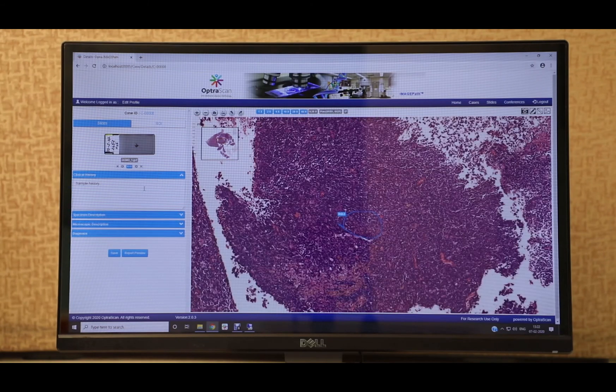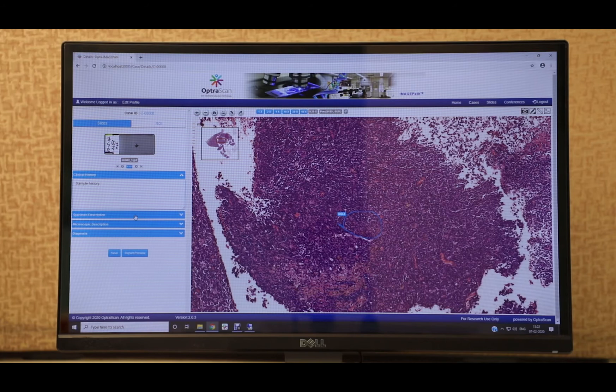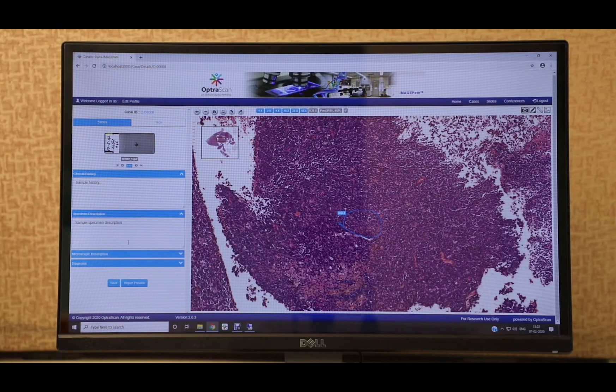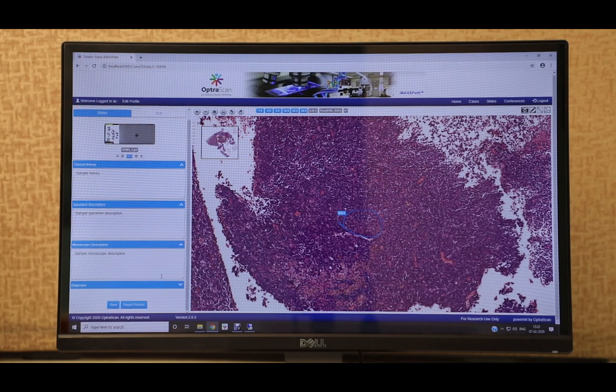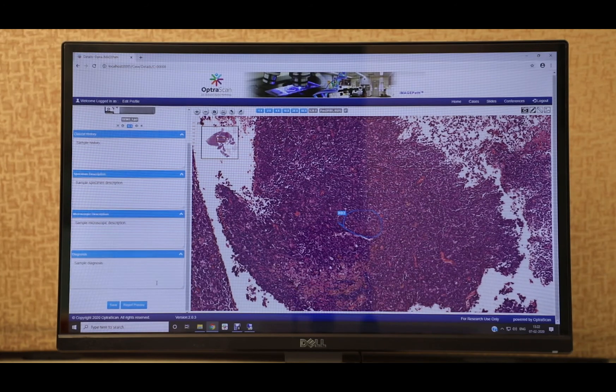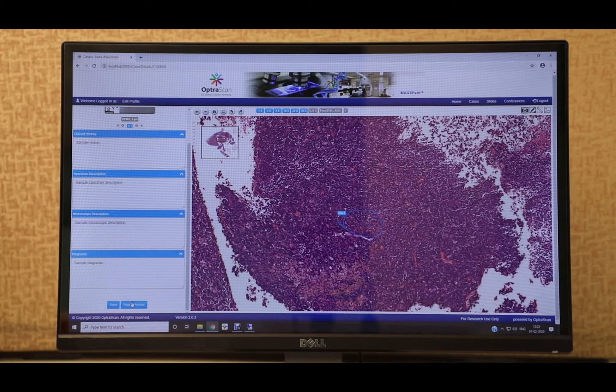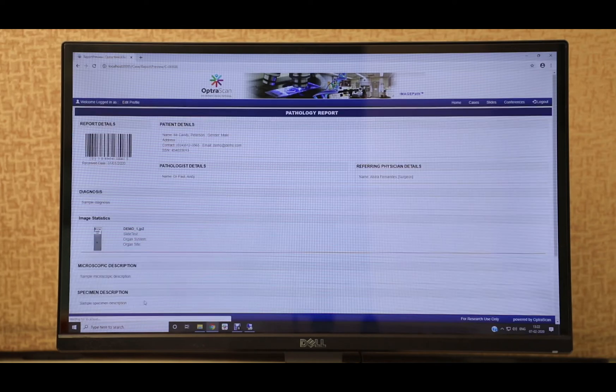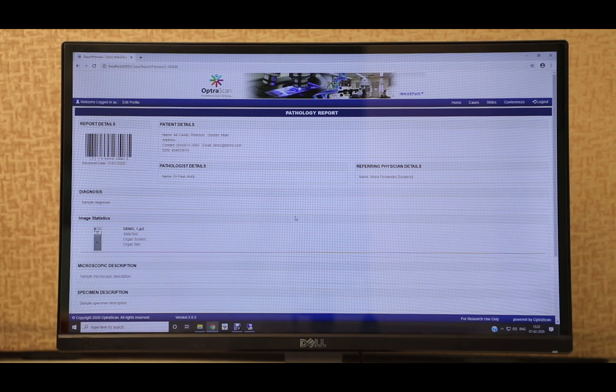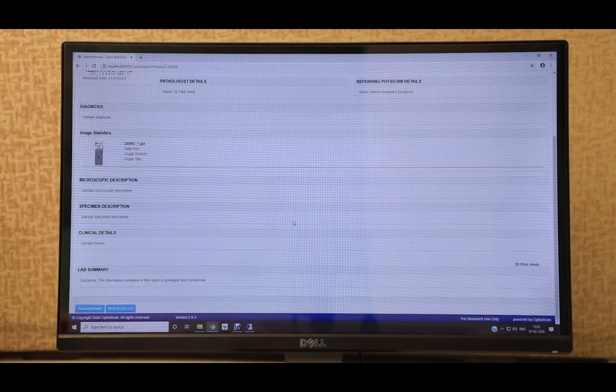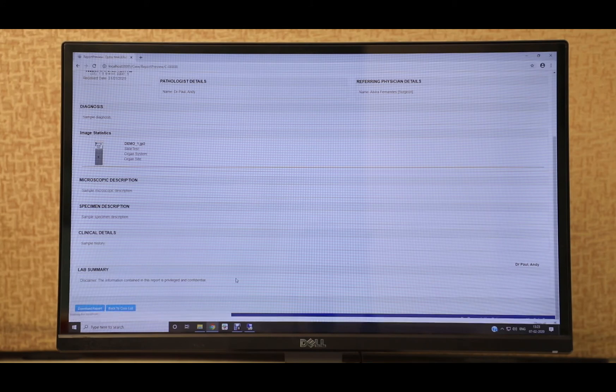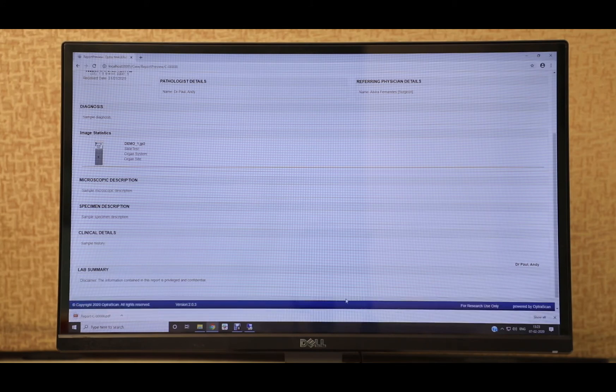There is also a reporting panel on the left which allows the pathologist to easily generate reports for cases. The ImagePath database can also be integrated with the LIS database currently in place at any establishment. The final report can be downloaded as a PDF and sent to the end user.